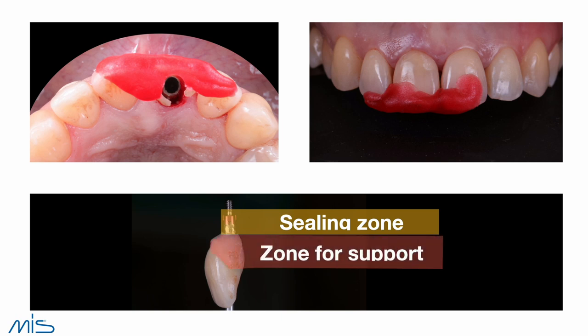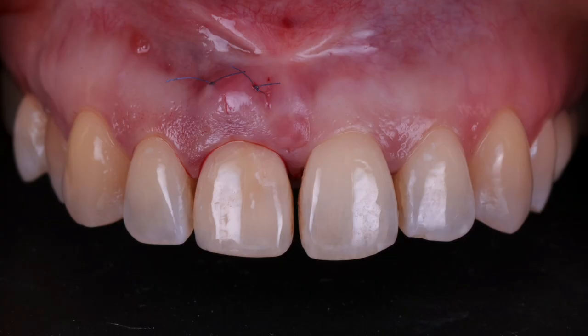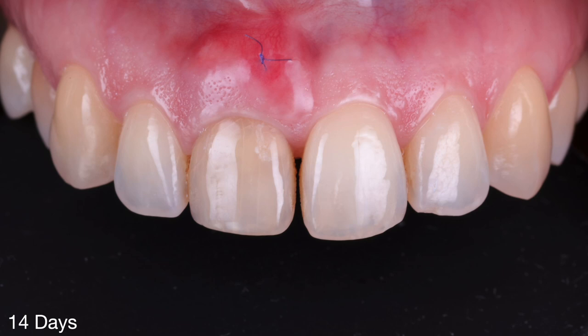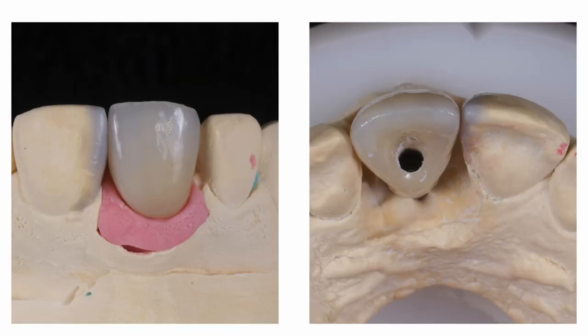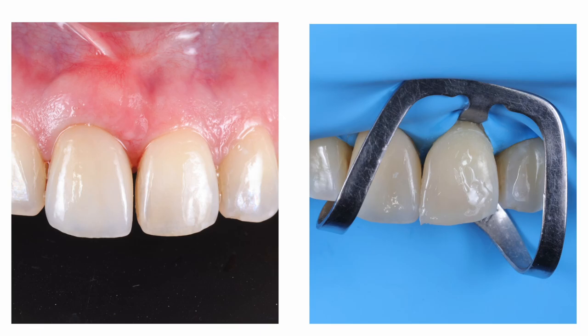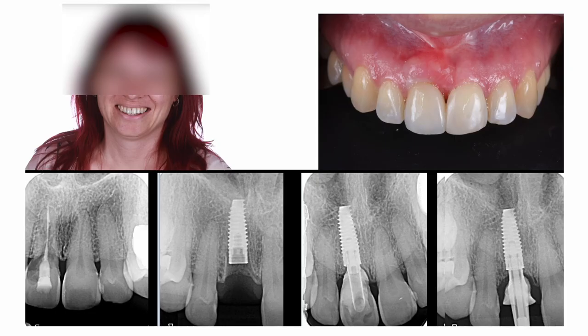We use this seal zone to support the soft tissue — the proximal parts support the papilla, and the buccal part supports the tunnel flap and the graft in the correct place. This is the situation after suturing. At 14 days when I remove the sutures, and at four months, we have a very good profile. From here we just need to copy that perfect profile and create a new crown. We also have some composite on the neighboring incisor to achieve the same width for both central incisors. This is the final crown in place.